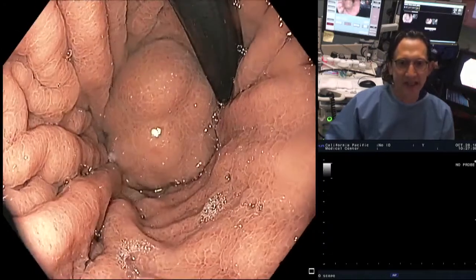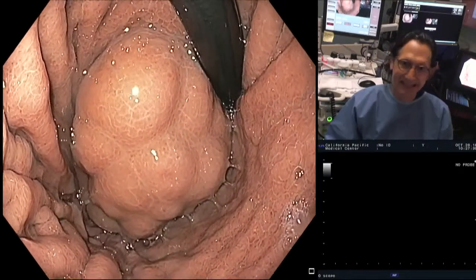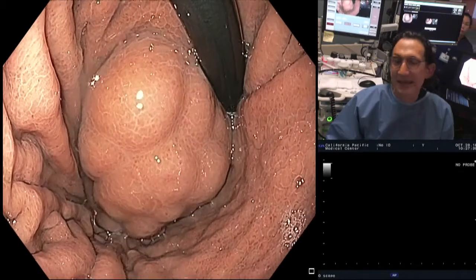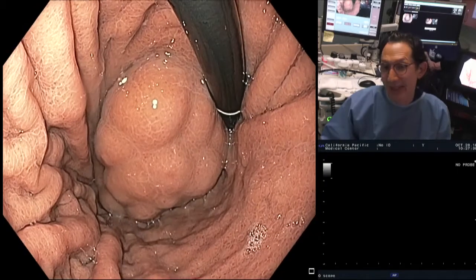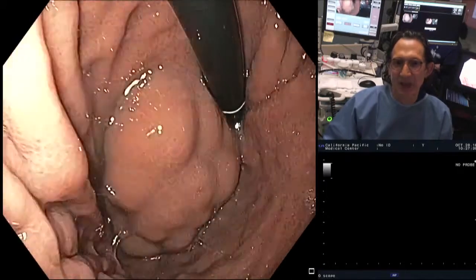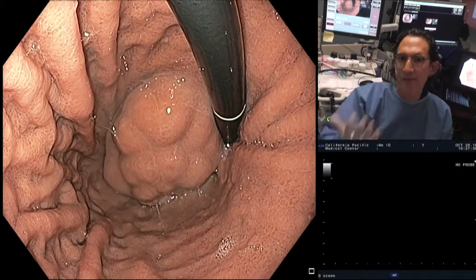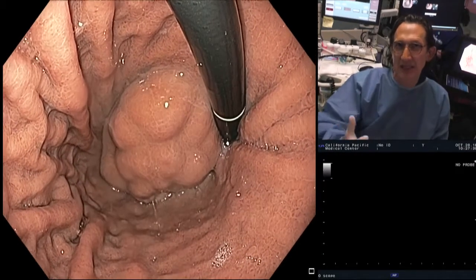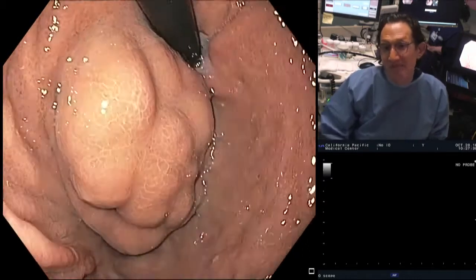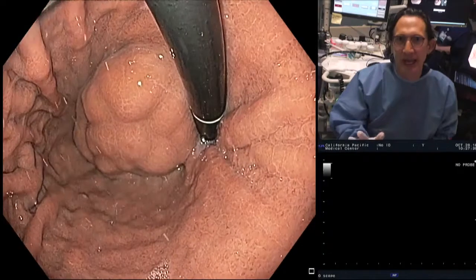Now, you already see this large convolute that's starting to protrude toward us, and it is large. In fact, it's scary, right? I mean, if this were to bleed, I'm actually surprised that he survived his last bleed, because this is under very high pressure. You're looking at the tip of the iceberg. So there's a large convolute of gastrorenal collaterals behind this. You might even wonder whether this is a bit at the margin of what we can accomplish. But let's look at it with the US, okay?